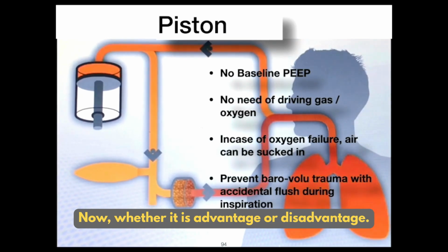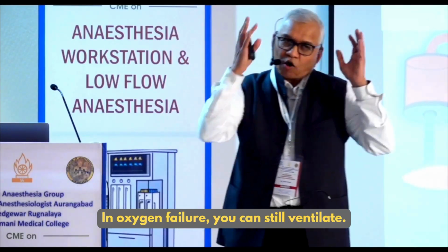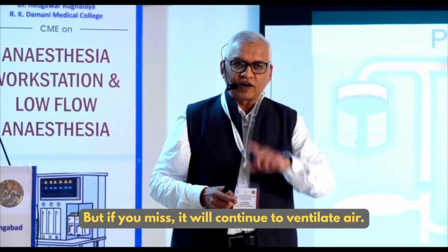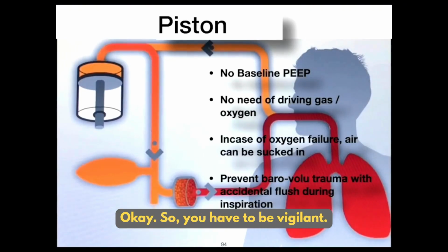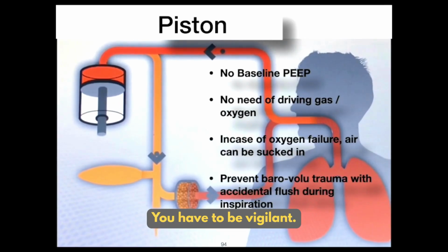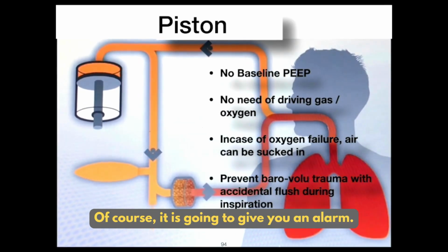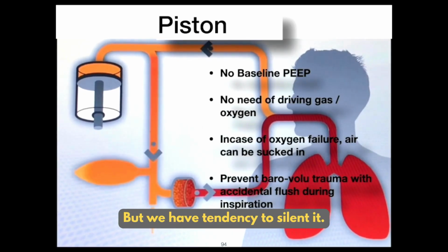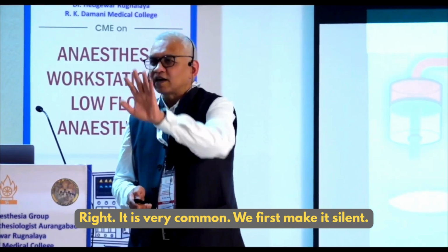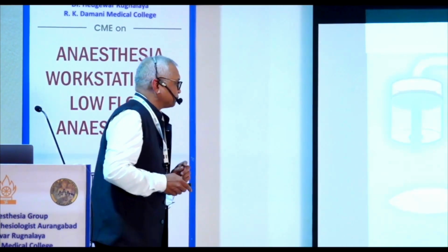Now whether it is an advantage or disadvantage, you can take it both ways. Advantage, yes, in oxygen failure you can still ventilate, but if you miss it, it will continue to ventilate air. So you have to be vigilant, there is no second thought on that. Of course, it is going to give you an alarm, but we have a tendency to silence it. It is very common. We silence it first, then think about what it was. So that behavior we should change.